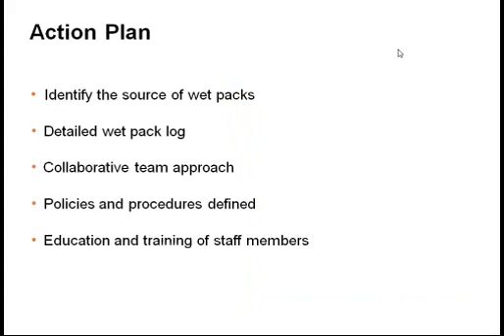In summary, we know that the source of a wet pack issue is extremely difficult to solve. A detailed wet pack log will aid in the investigation of the problem. Staff members who are involved with wet pack preparation and sterilization should be properly trained and follow the facility's policies and procedures. A collaborative team approach can facilitate the process when conducting a moisture assessment.